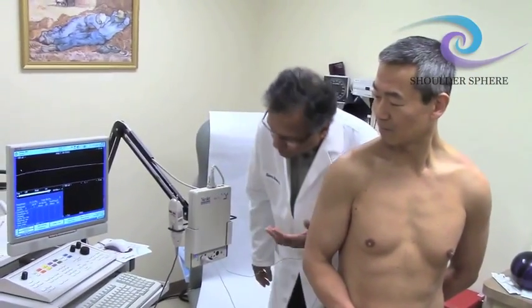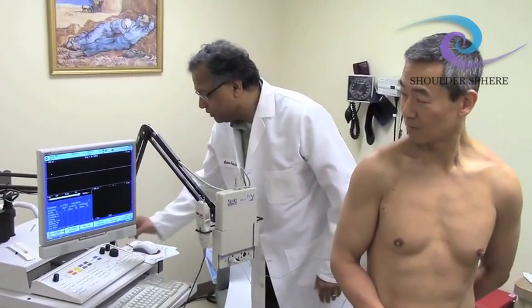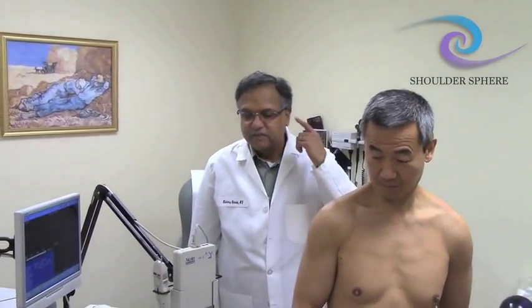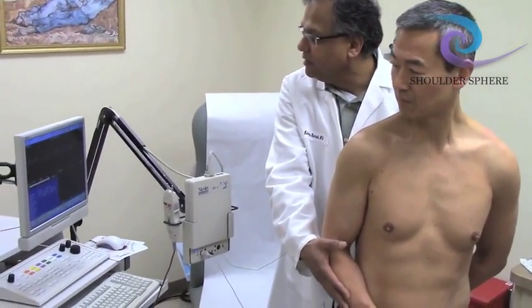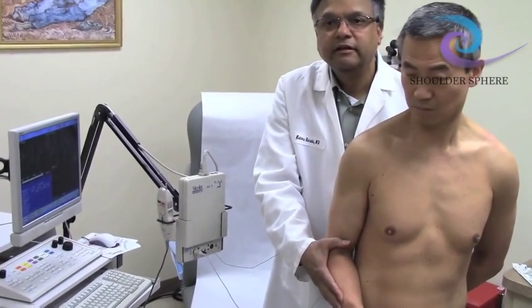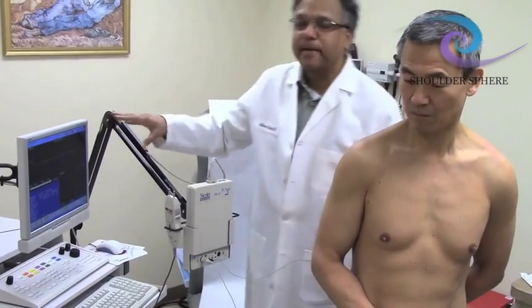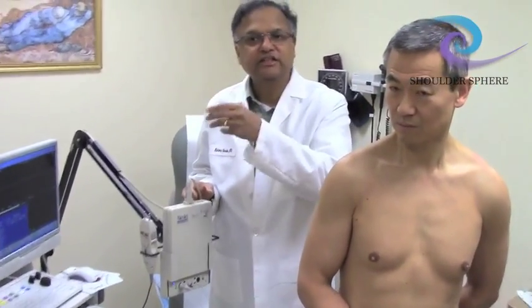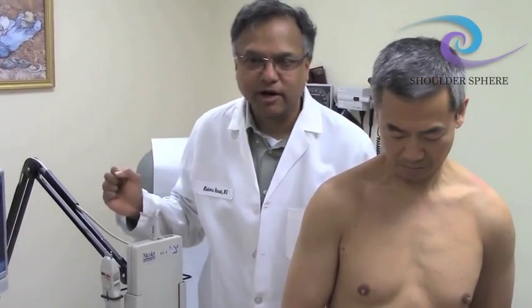When we perform EMGs clinically, we use audio because, believe it or not, if there are any abnormal signals, they have a characteristic audio signature, and the human brain is better at detecting noise changes than visual changes. This is how a normal sound would be. If there's any dropout in motor neurons — if some nerve cells are not working or muscle fibers are damaged — you can actually hear the interruption in the sound. After training on this a while, you can close your eyes, put a needle in the muscle, and know exactly what the problem is because audio recognition is so much quicker.